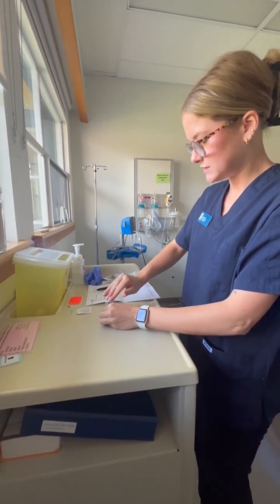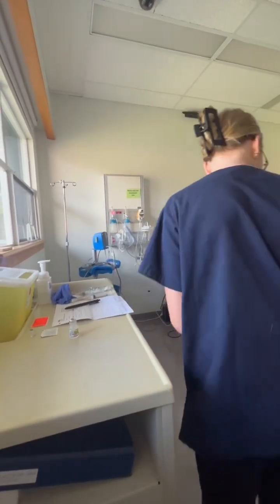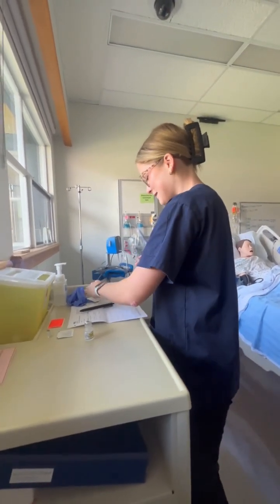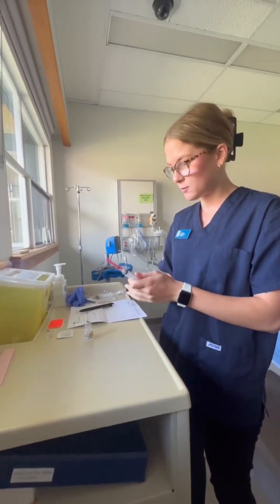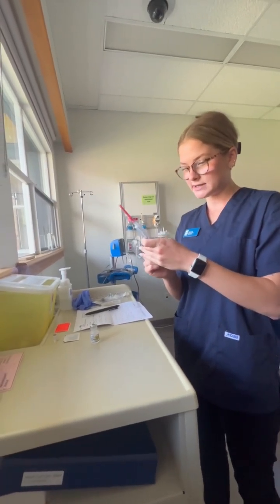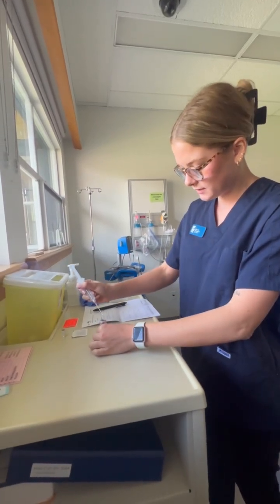And for time purposes, this is not going to be 30 seconds and not letting it dry for a long time, but that is what it is. I've also technically cleaned the morphine, but anyways, because I'm drawing up from an ampule, I do have a filter needle here. I'm going to draw up, according to my math, 9 milliliters of normal saline. So I'm going to inject 9 milliliters of air into the normal saline here.